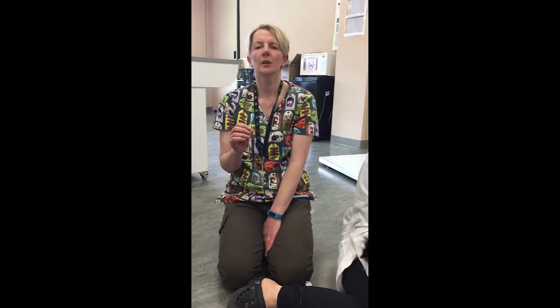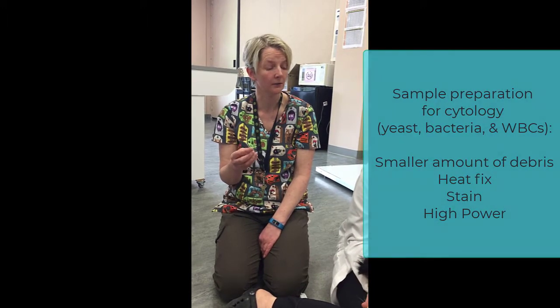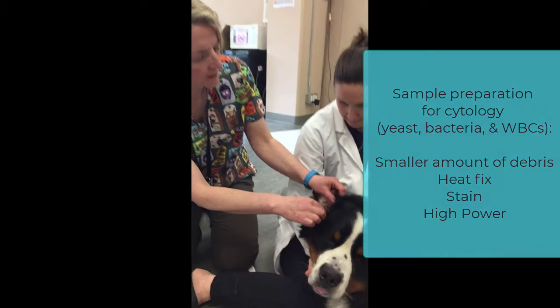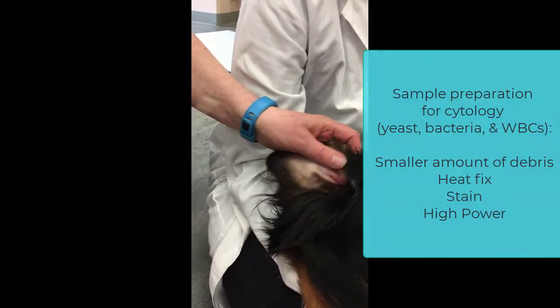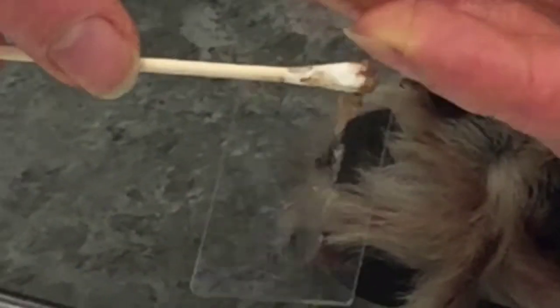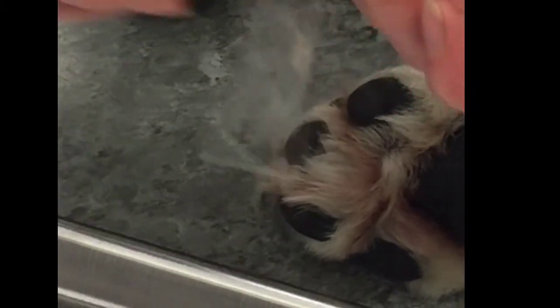When I want to do a cytology examination to look for yeast and bacteria and white blood cells, so looking more for an ear infection with bacteria or yeast, I don't need quite so much. I just need to get my swab kind of dirty, and then I'm just going to roll a thin layer in this case onto the slide. This is actually still quite thick, so I'm actually going to make it a nice thin layer. Like that.